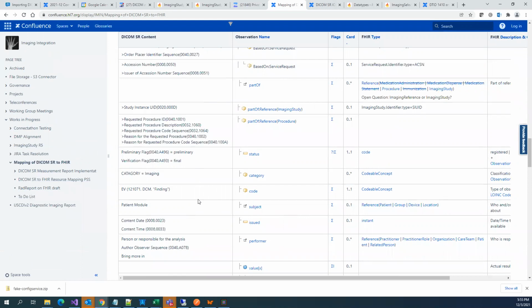But there are hardly many mandatory attributes in observations actually. Whatever we find in our mapping, if we create a resource out of it, that would still pass. But anyway, I will check that profile part. So for now, we are using R4.